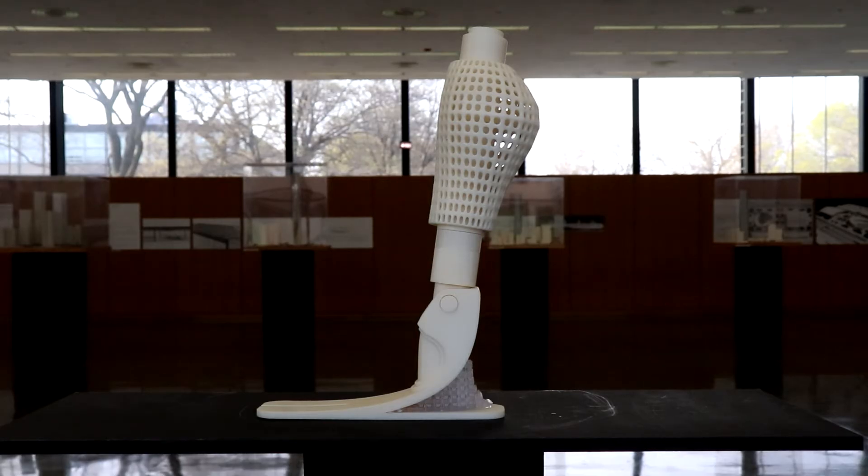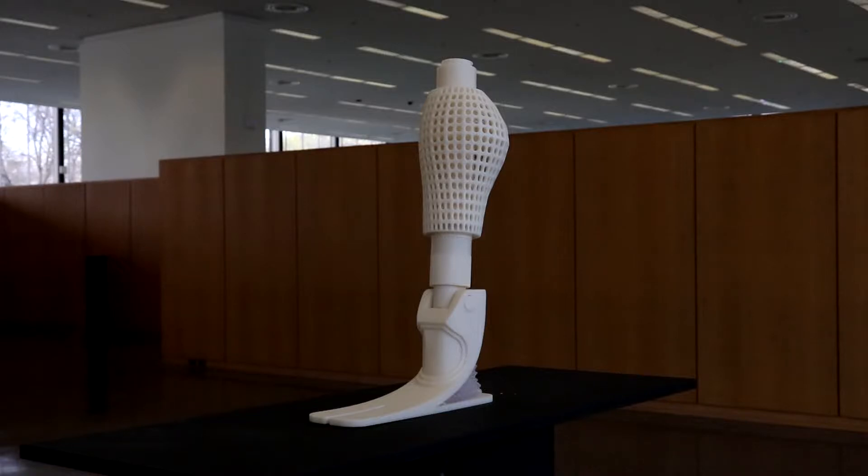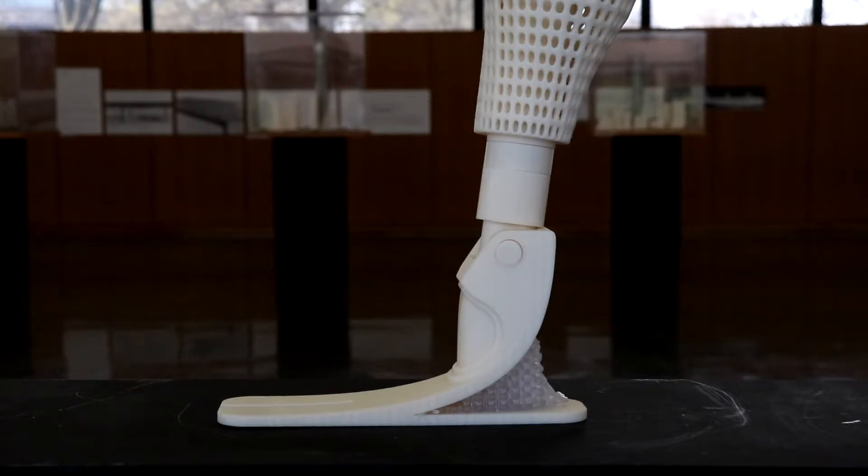That's when we decided that there was a need to design a low-cost extendable transfemoral prosthetic using generative design and 3D printing.